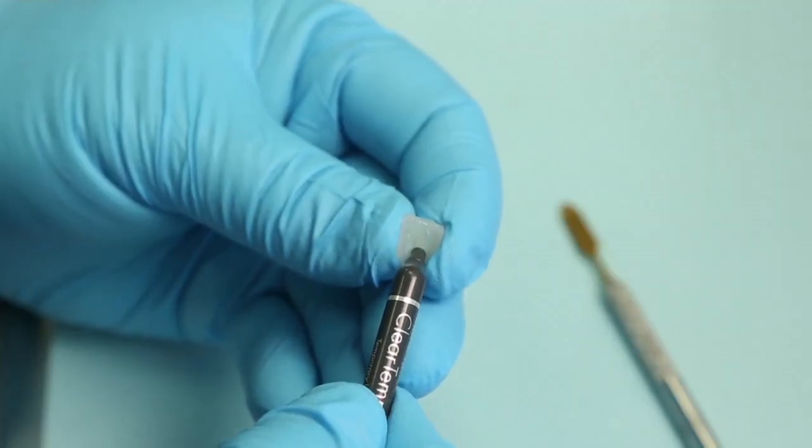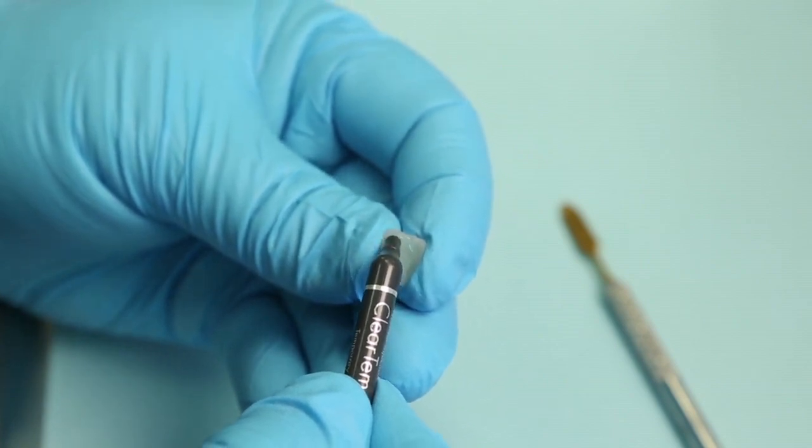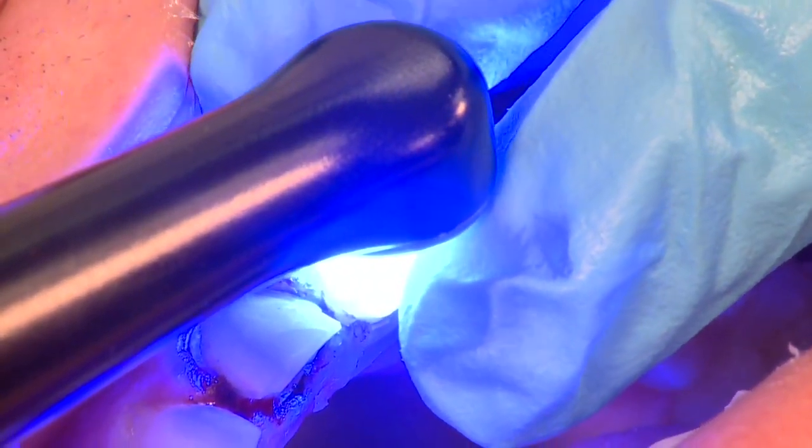So the ClearTemp LC is designed to totally seal and totally coat all the preparation and all of the underside of the veneer. Light cured, removing the excess with ease.